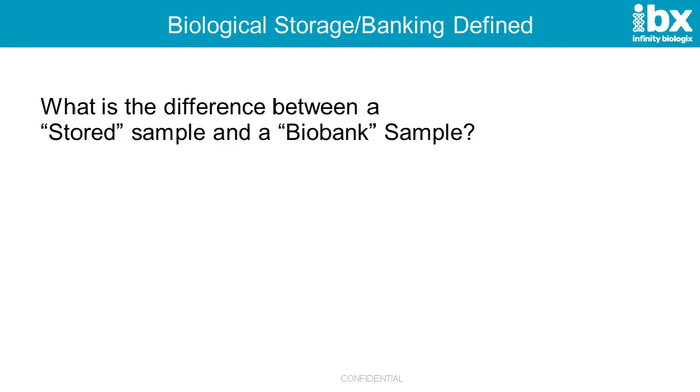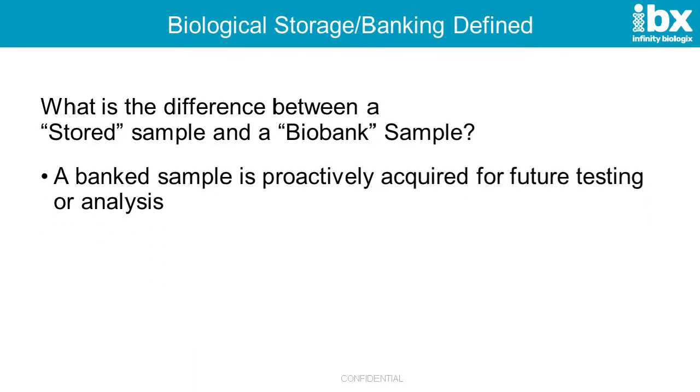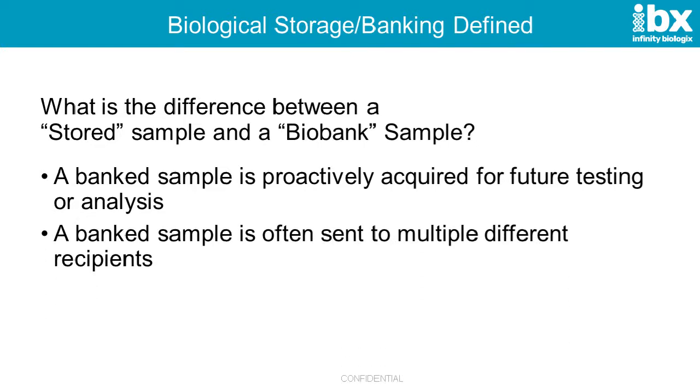It's really important to understand the difference in collecting biomaterials and biological samples. What's the difference between a stored sample and a biobank sample? A bank sample is one that's proactively acquired for future testing or analysis. So not necessarily a question that we're going to ask now, but when we bank a sample, we need to understand everything about the metadata and the quality of that sample, because it may be a long period of time before it's tested. And a bank sample is also sent to multiple different recipients.